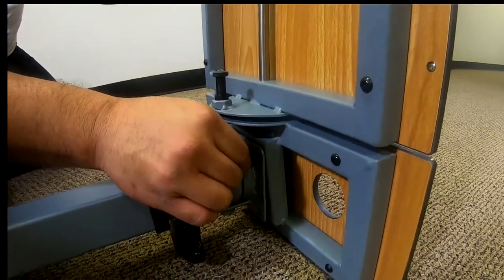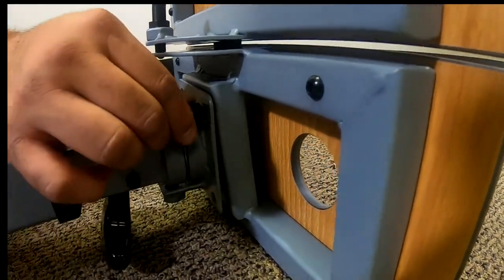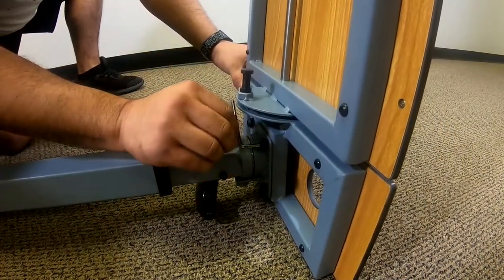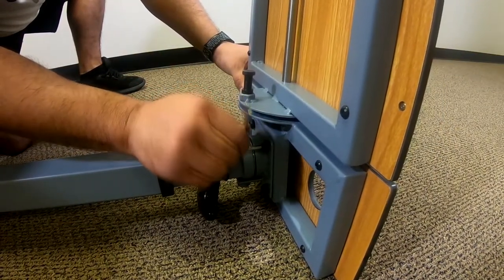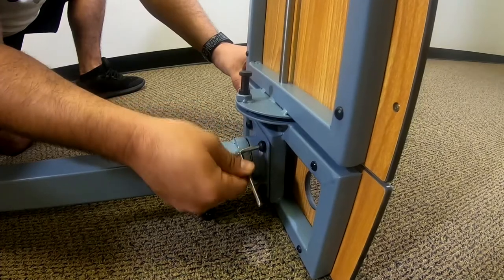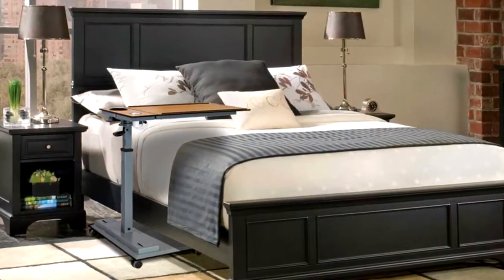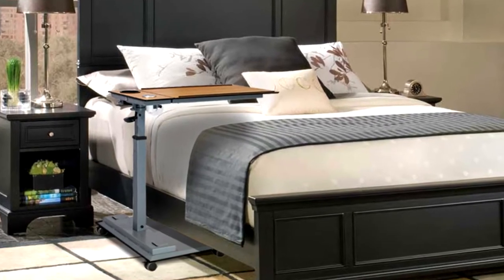Install the remaining three bolts the same way. Use the included Allen wrench to tighten the bolts. Gently rock the table top as you firmly tighten the bolts to assure it is snug. You're doing great and we're almost done!